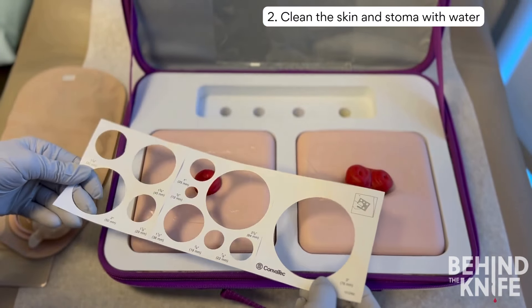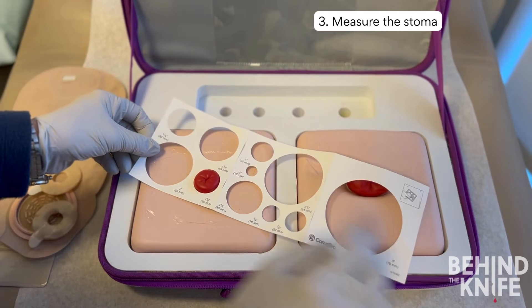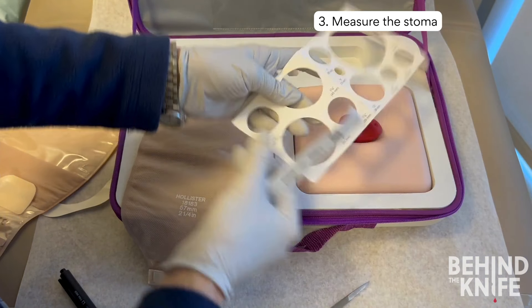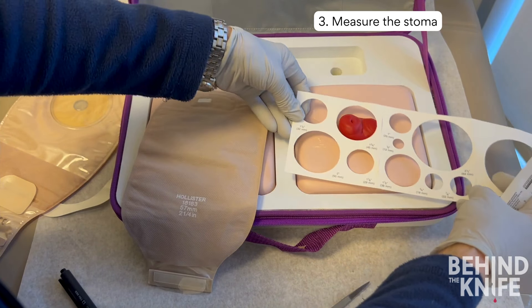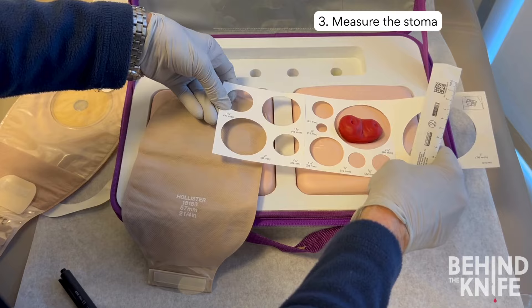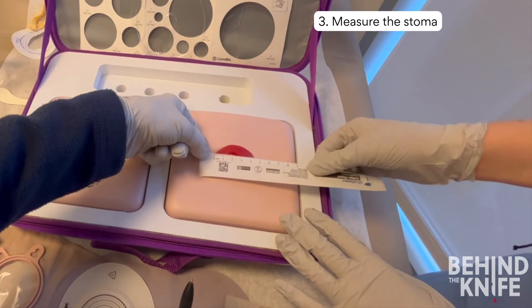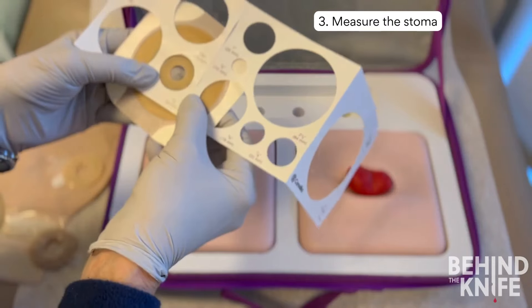Next, you need to measure the stoma and cut your appliance appropriately. Many ostomies come with a template that can help you measure. These work really well for end ostomies, which tend to be more circular. However, loop ostomies tend to have an oblong shape and these templates don't work as well. If you're having difficulty finding a template pattern that fits your stoma, you can always measure the stoma in the horizontal and vertical axis, then use these measurements to cut your appliance accordingly.